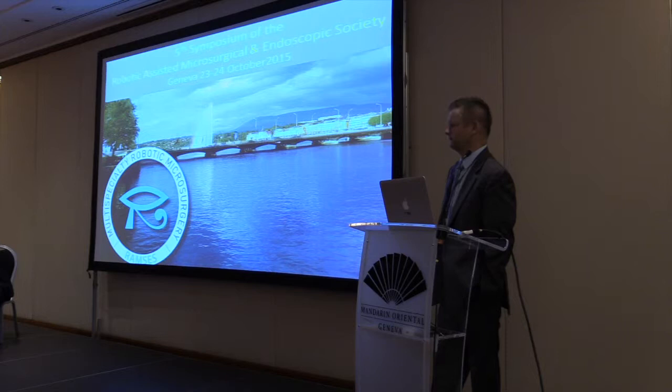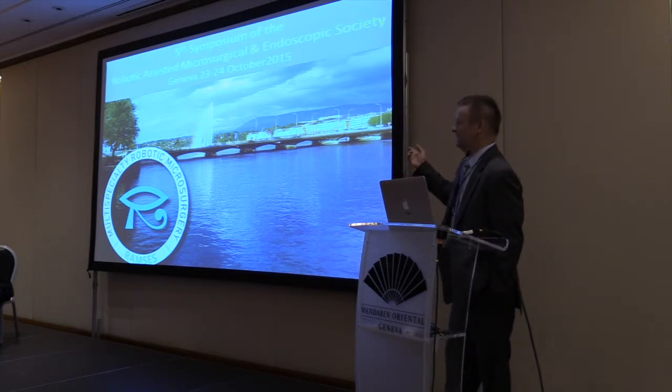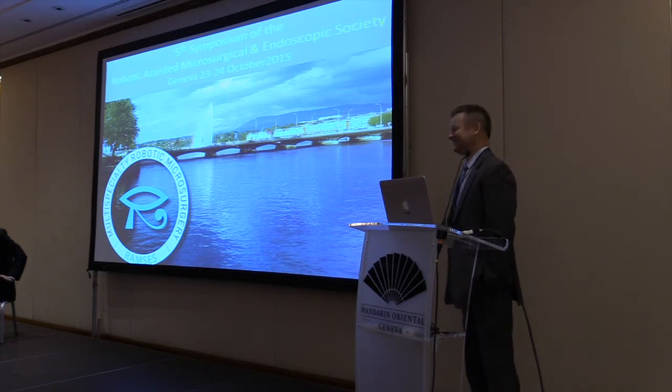And the urologists want to say that you did a fantastic job with this renal bypass. Yeah. Iliorenal bypass, it's fantastic. Sometimes I get the question, why ilio? Why not aorto? Renal bypass is a short way. Because it was dissection, and the left iliac artery was the only artery without that dissection. It was impossible to perform otherwise. You also took the carotid artery. Yeah. Thank you. Thank you.